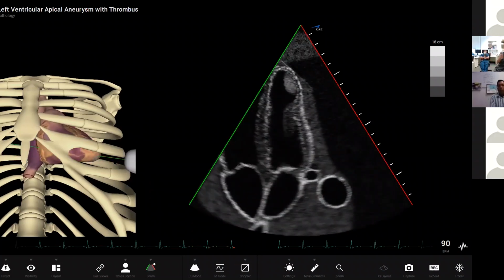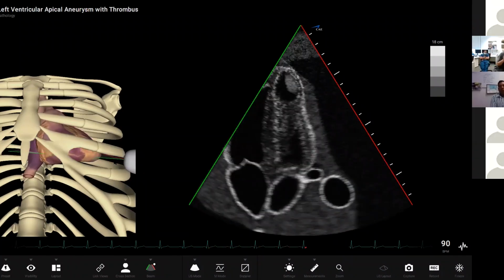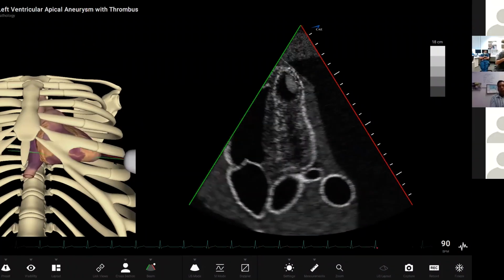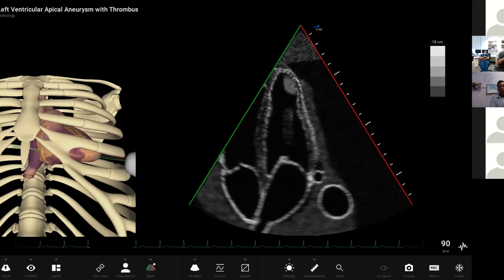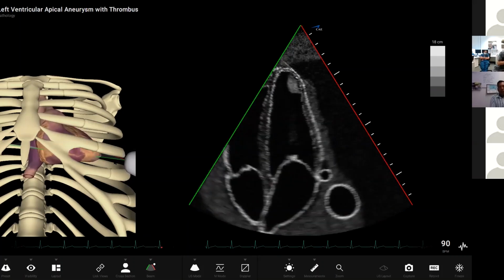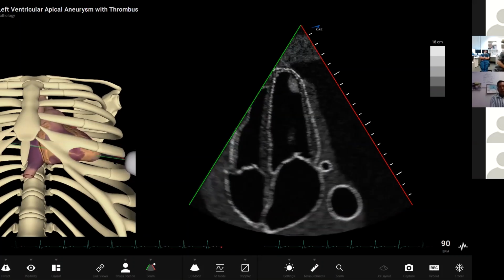Yeah, nice. I don't know if you heard that. Hassan was just saying, asking the patients to take a small breath. Breath hold maneuvers can be really useful as well. Take a breath, hold it, be ready for it, image it. Don't forget to tell them they can breathe again.